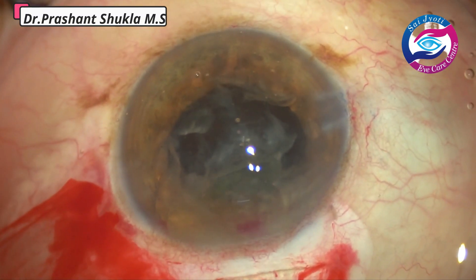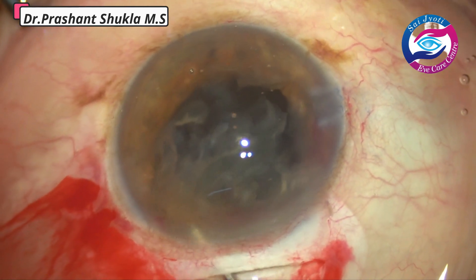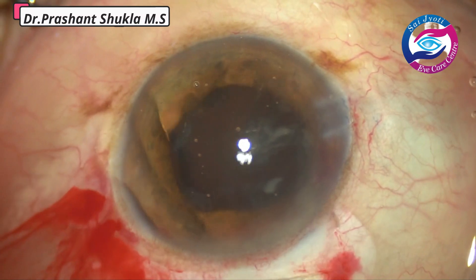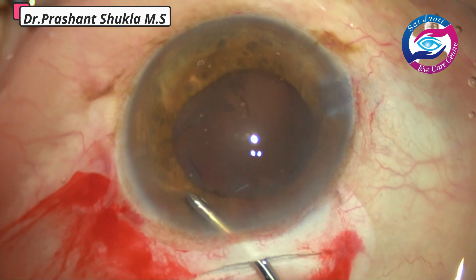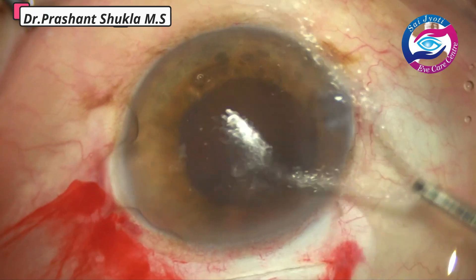Here I am demonstrating the use of bi-manual irrigation aspiration. Just the irrigation handpiece is used to flush out all the cortex by pressing the posterior lip of the wound. With the flow of the water jet, the majority of the loose cortex comes out just by irrigation.